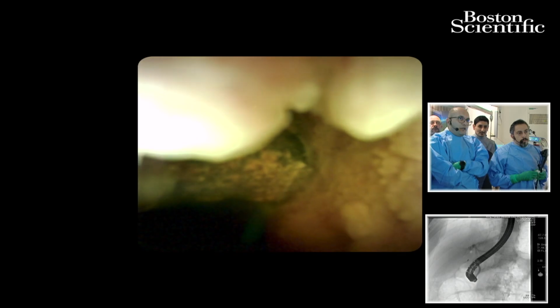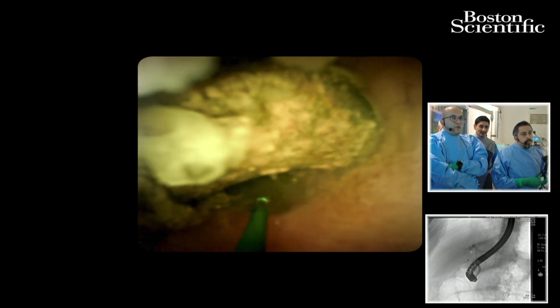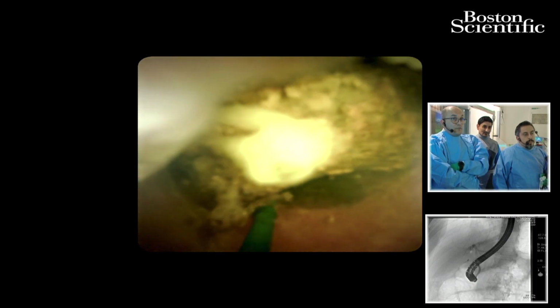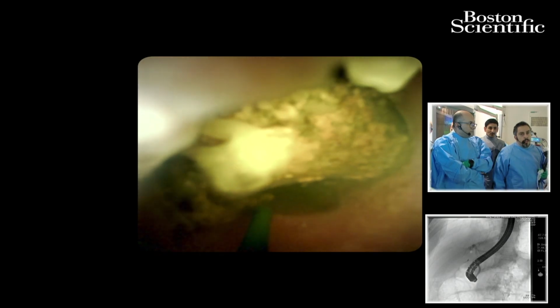Yes, we will see. We will make another look also after the lithotripsy, and maybe we can take small biopsies from this small papillary projection in the distal end of CBD. Yeah, I think it's probably mostly an inflammatory stricture. We didn't see any new vascularization. There's definitely no mass lesion. And the most important thing is the age and the clinical presentation are all going with a benign stricture.